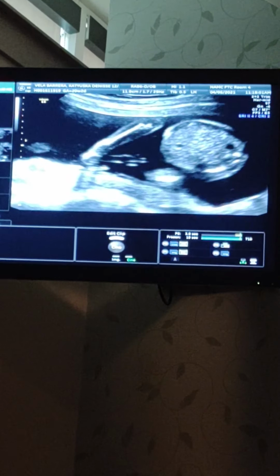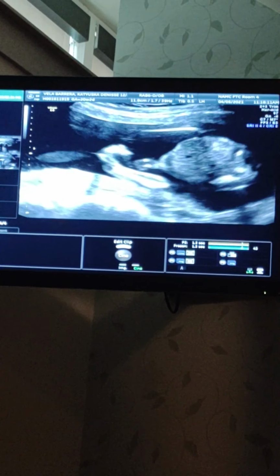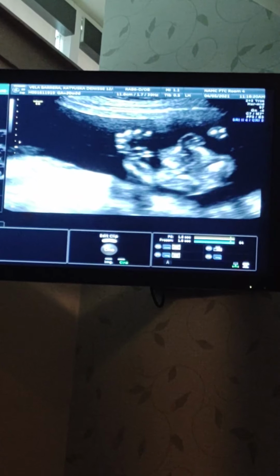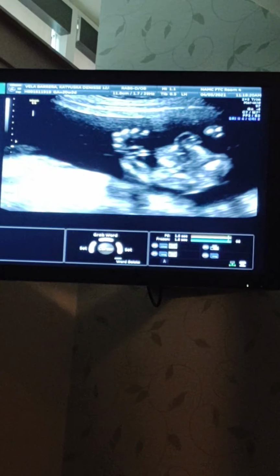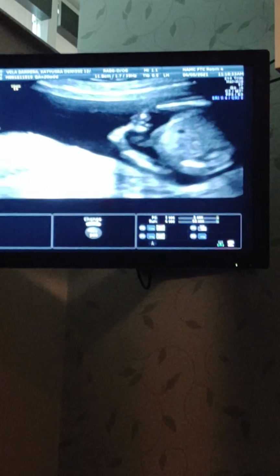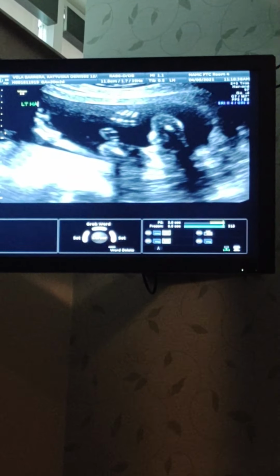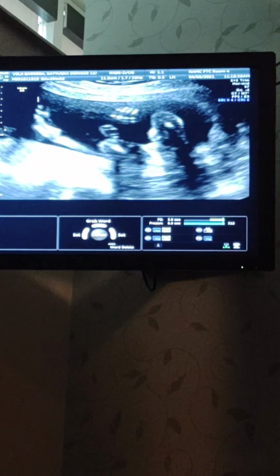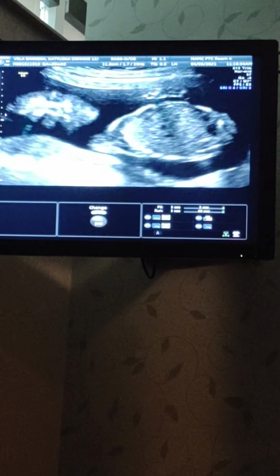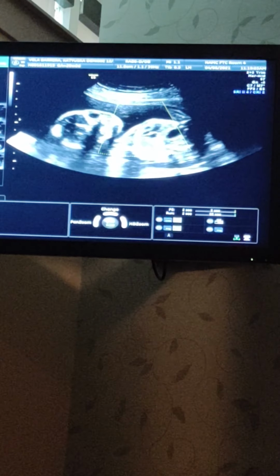Upper extremity, that's the forearm, and that's on the left. There's the right one down below here. Fingers. The left hand up on that top there. Left hand, right hand, here. He probably feels a warm jelly. A little bit of pressure from me, you know. Let's zoom in on the heart here for a minute.